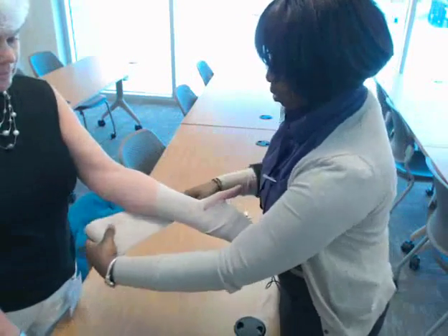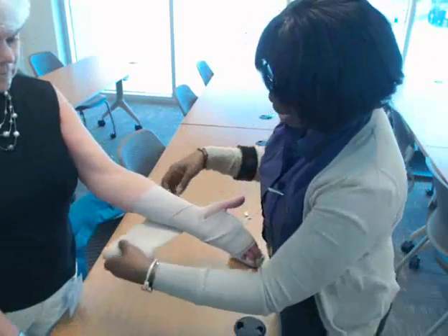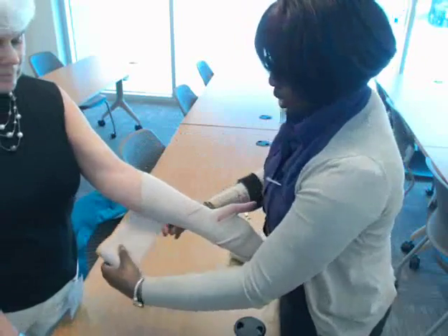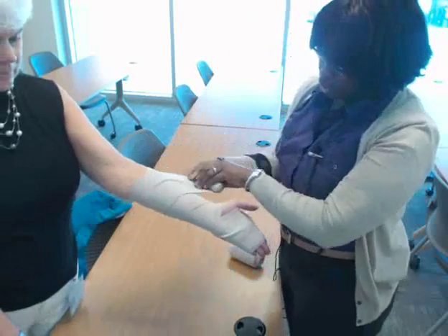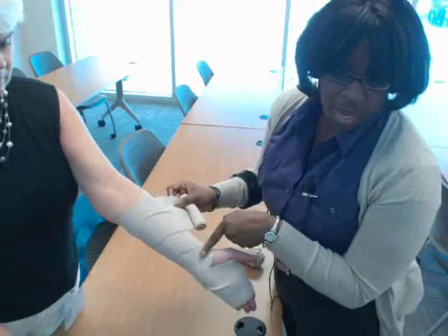Do your figure eights going up, down and come back down and around. You are going to make like an X with the bandage — up, down and come back around. You can see the criss-cross pattern in the figure eight happening there.